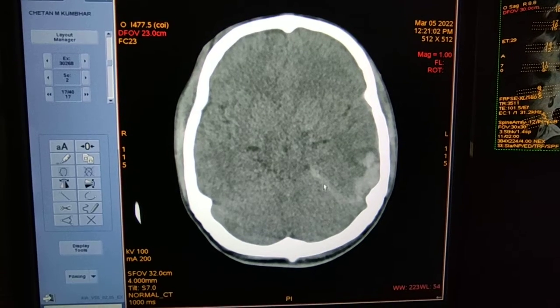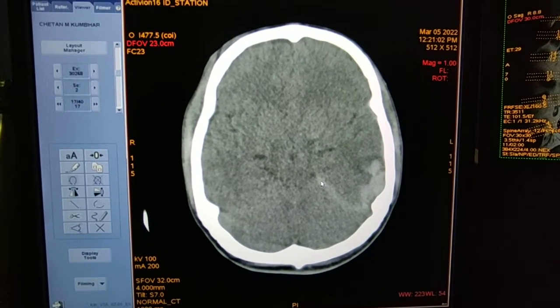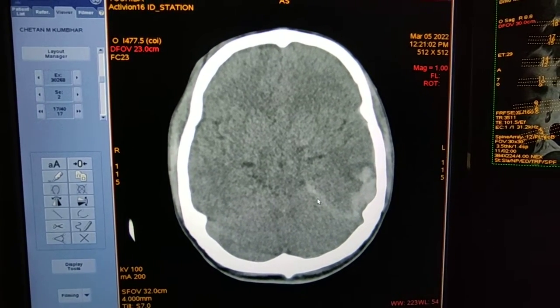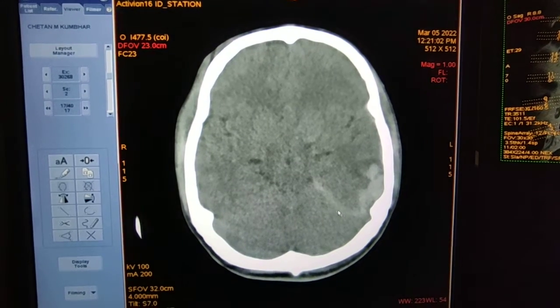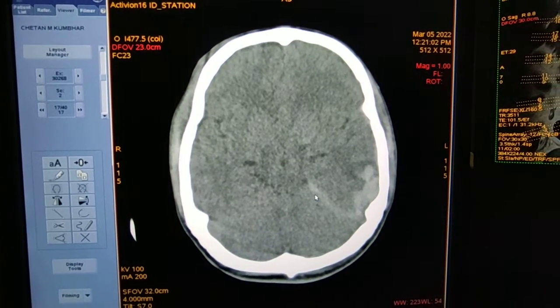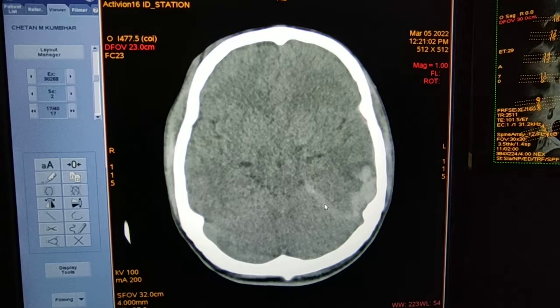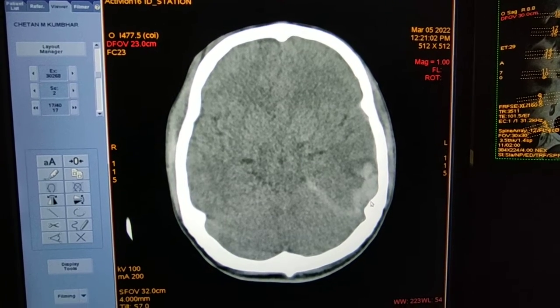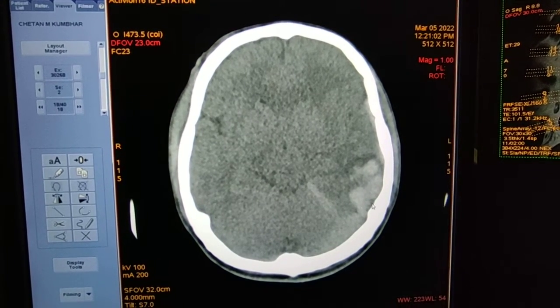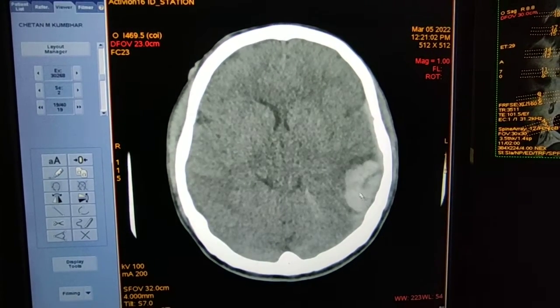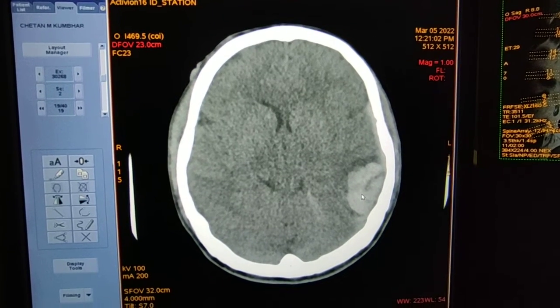Here is a thin strip of hyperdensity in the left tentorium — this may suggest left tentorial hemorrhage. This is a large hyperdense lesion in the left temporoparietal lobe.